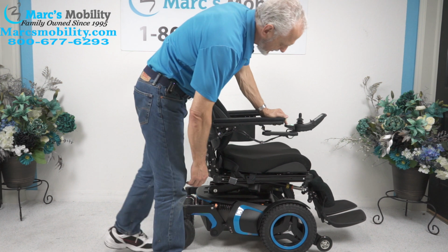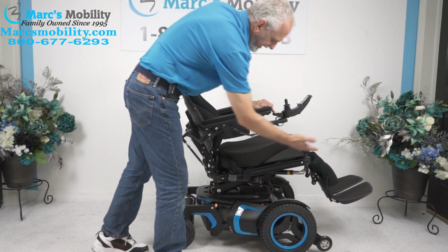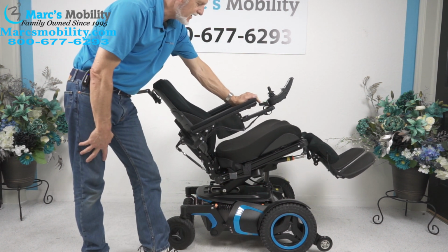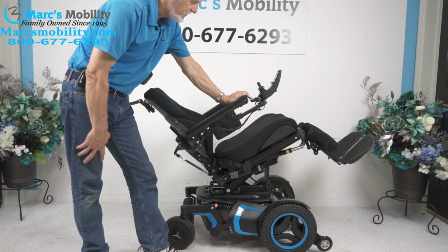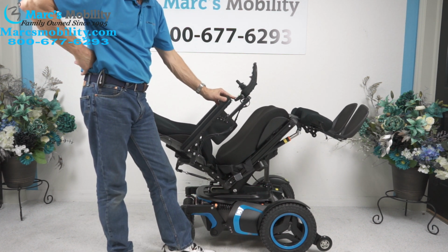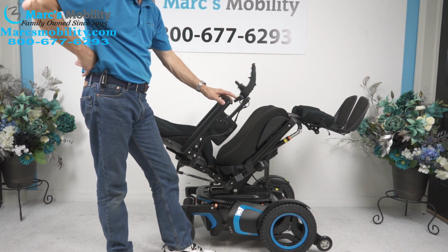The electric tilt is when the base right here goes back. So when this goes back, it's going to take the legs, it's going to take the back with it. Okay? This is called the electric tilt. So this is as far as it'll go, right here. The next feature I'm going to show you is called the electric legs.